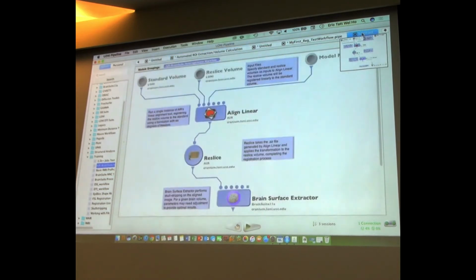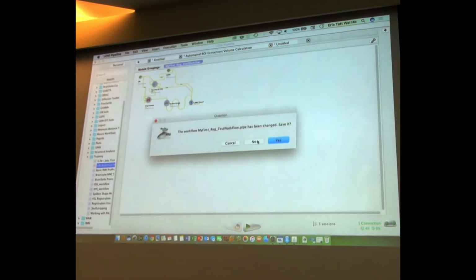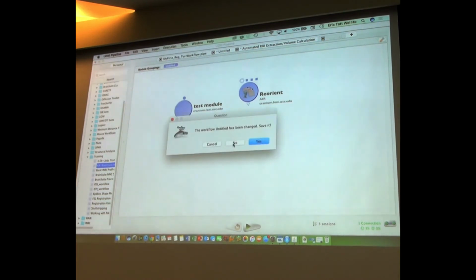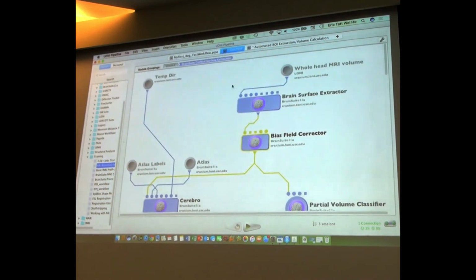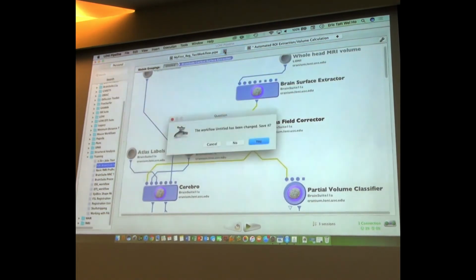This one we're going to get rid of. This one we're going to just close. This one we're going to close. Let's keep that one. So that was the one that failed. We can close that.